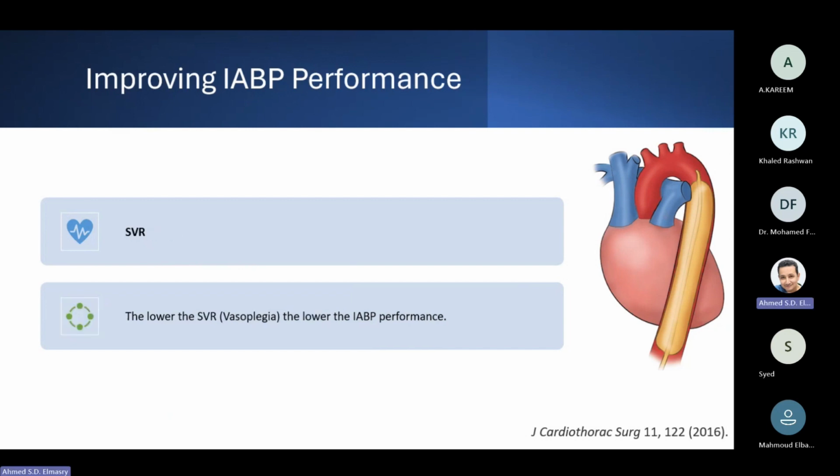As I said, the systemic vascular resistance will affect the intra-aortic balloon performance. In cases of vasoplegia, the diastolic augmentation will be very little.